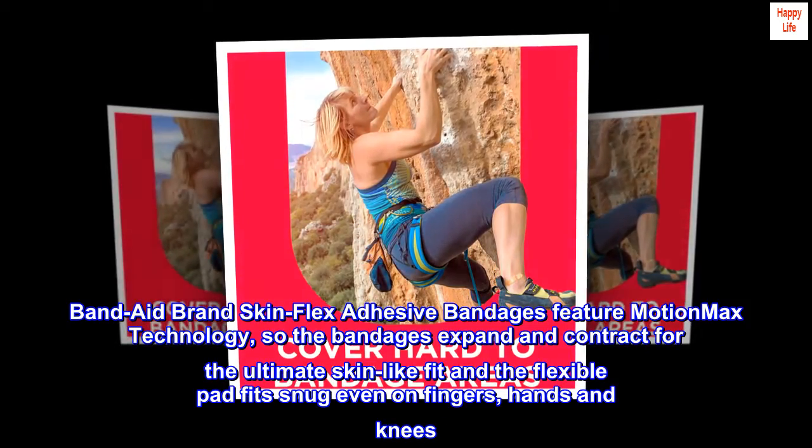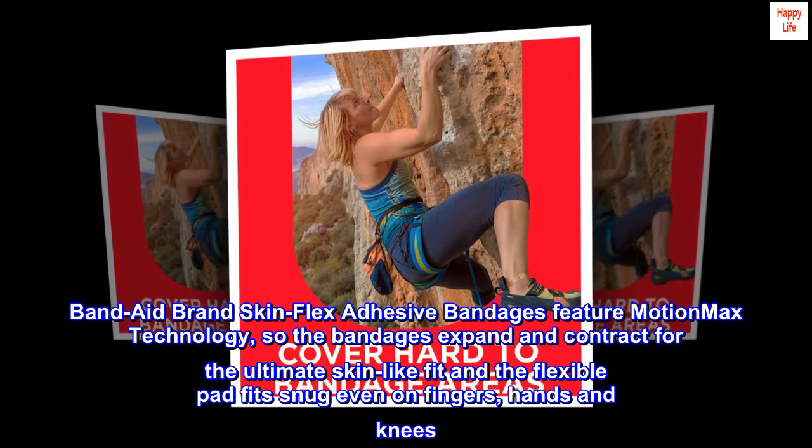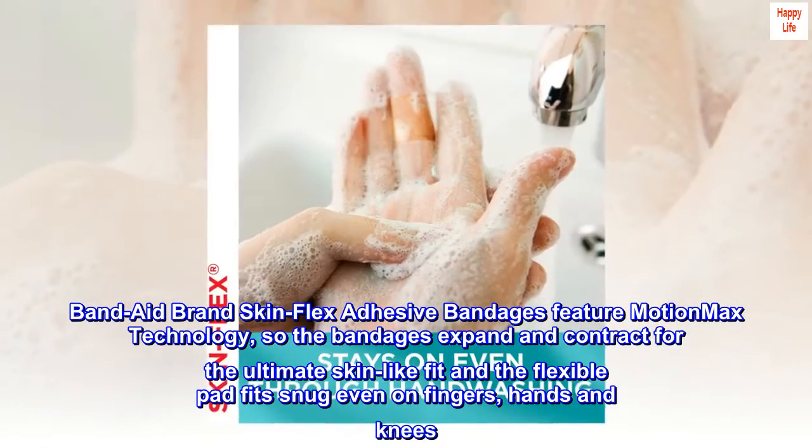Band-Aid brand skin flex adhesive bandages feature MotionMax technology, so the bandages expand and contract for the ultimate skin-like fit, and the flexible pad fits snug even on fingers, hands and knees.